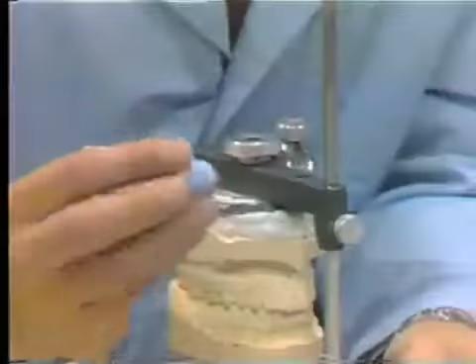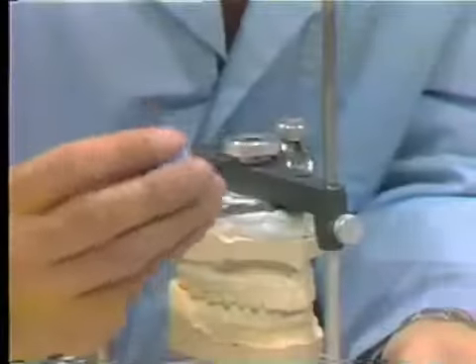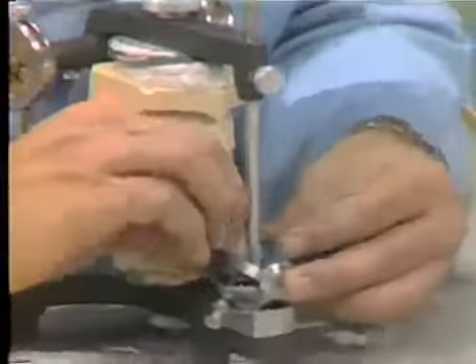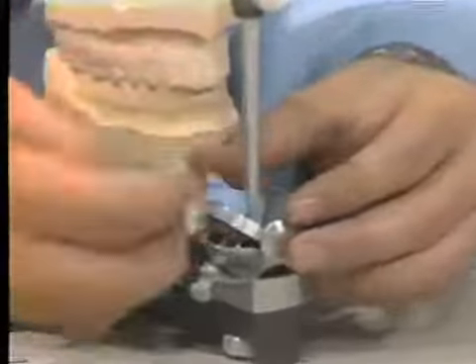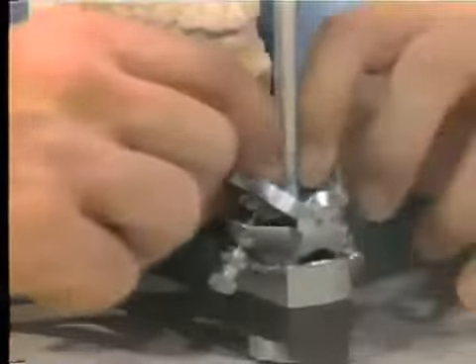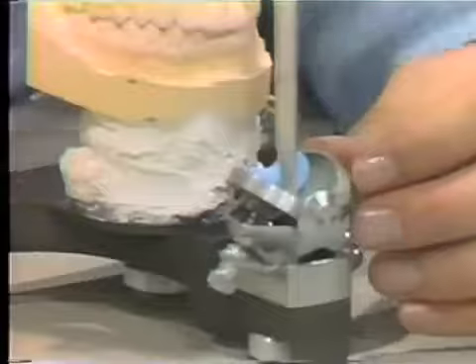You can see it becomes very pliable and non-sticky. Now we're going to put it into the back part of the articulator. Put just a small portion and lock it under the inclined wings of the incisal guide table.